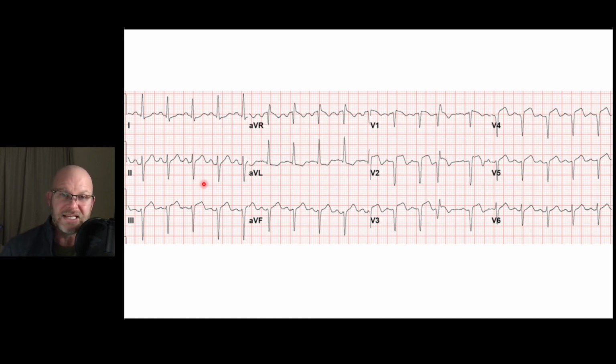So just 3 leads can give us an idea of where this energy is headed, which can lead us to other interpretations for EKGs, which we'll get into later.